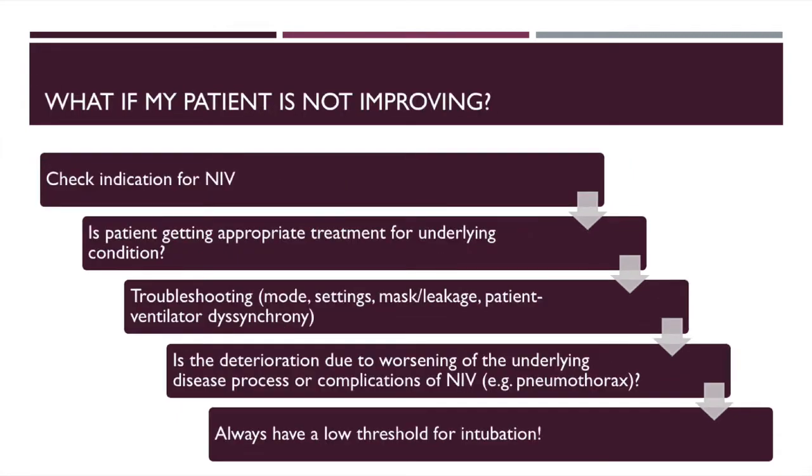Monitor your patient closely after NIV has been initiated. If your patient does not show signs of clinical improvement, ensure that NIV had been started for the appropriate clinical indication. As NIV does not correct the underlying pathology, ensure that your patient is receiving appropriate treatment, for instance, nebulizers for a COPD exacerbation. Check that the mode on the NIV machine has been appropriately set.